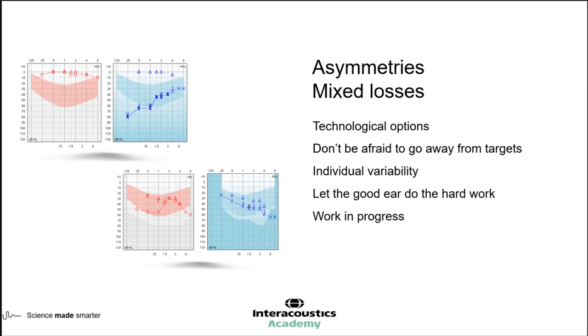I think it's really important that we never say never as well. Audiologists are typically very good at trying to predict the outcome of any particular given case, regardless of anything beyond the audiogram. But actually, for some people, a second hearing aid is exactly the right thing. For others, it's not going to do them any good.